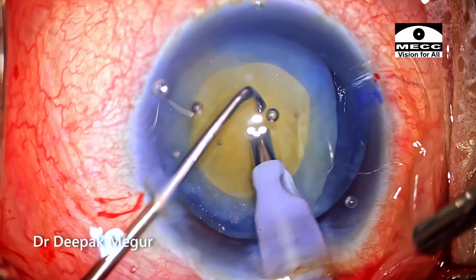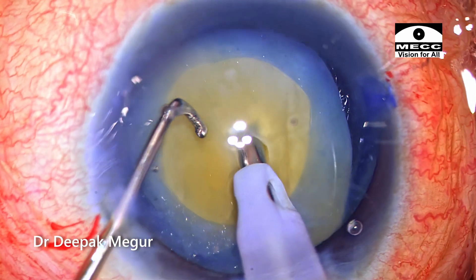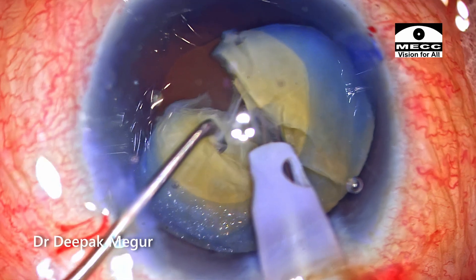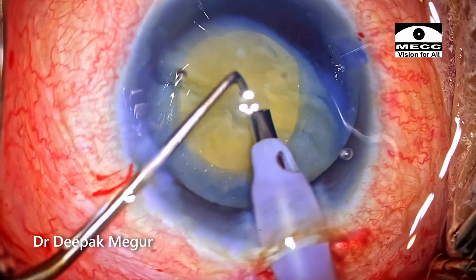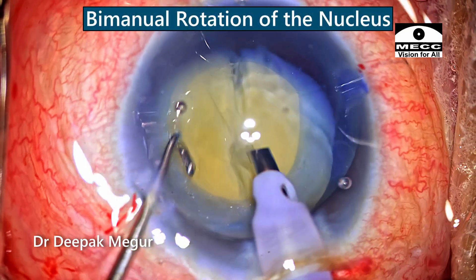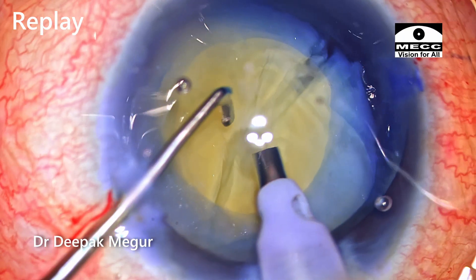The tip is buried into the substance of the nucleus and it is lifted up as the blunt chopper is introduced around the equator of the nucleus. I'm consciously lifting up the nucleus so that the chopper doesn't come in contact with the posterior capsule, which is expected to be extremely thin and friable. Once the scoring is done, I'm very gentle and not aggressive — not keen to achieve complete separation at the first stroke. The nucleus is being rotated using bimanual technique wherein the phaco tip and the chopper both move the nucleus around. This maneuver is going to be less stressful on the bag and the zonules.